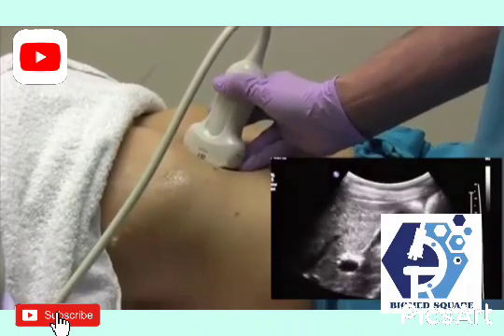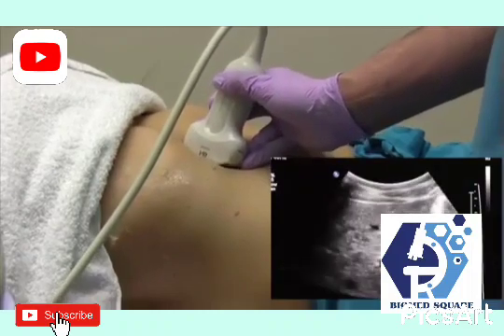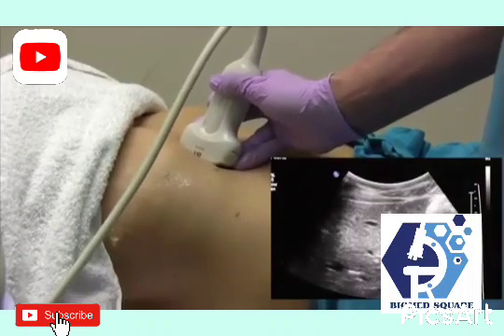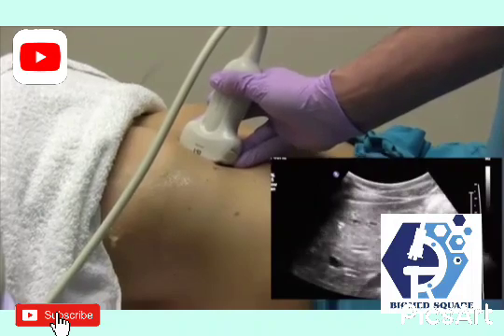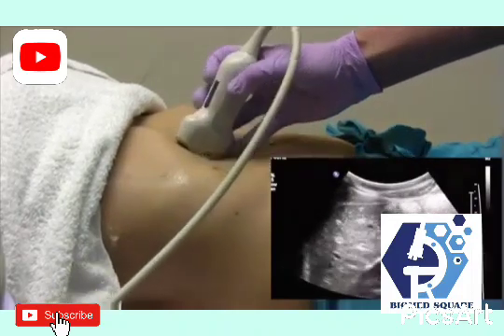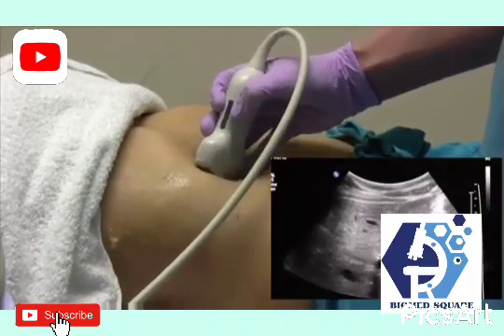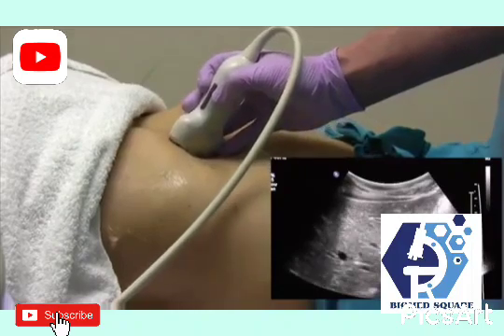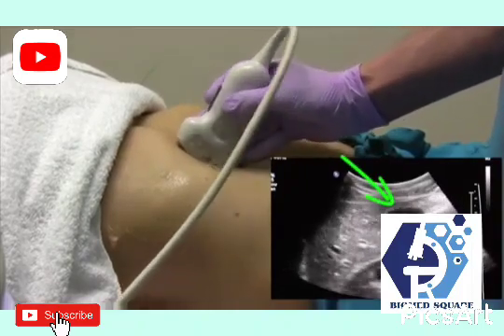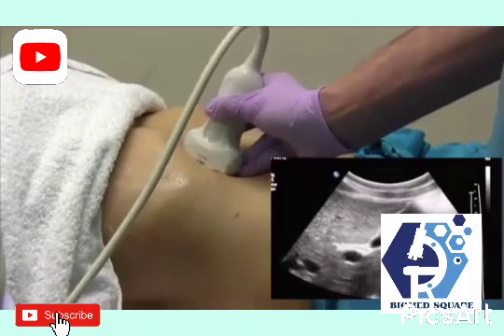Next, we'll get a transverse image of the gallbladder in this same window. And what you want to do is just look at your probe and think about in your head, if you turn your probe 90 degrees, you should be perfectly set up for a transverse gallbladder. So this is our transverse plane, and if you go back 90 degrees the other way, this should be your sagittal plane here.